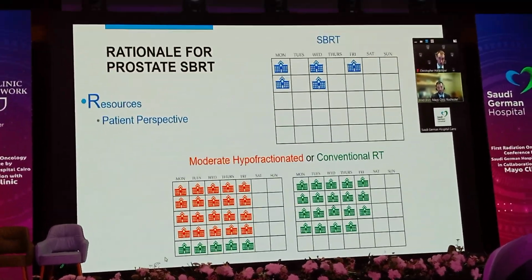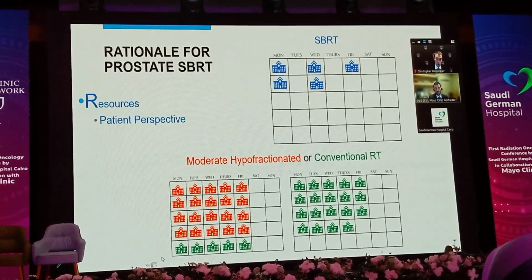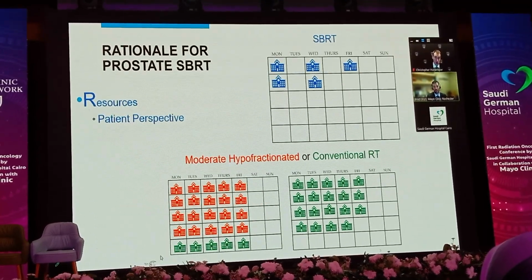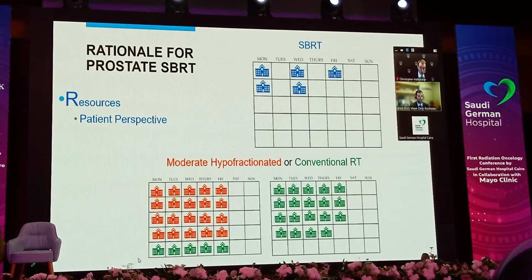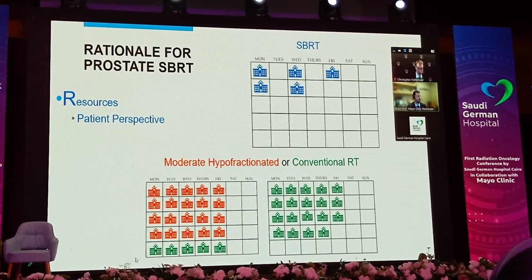less utilization of the treatment room and the treatment machine, less time away from work for the patient and their family if that's something that's important to them as well. So patients do definitely notice this decreased burden on them.